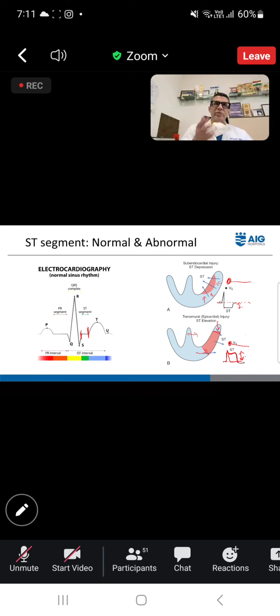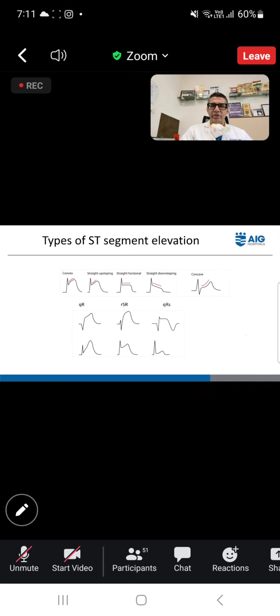So first you identify whether there is any ST depression or ST elevation. Then you find out how much it is, what is the type of ST elevation or ST depression, and in which areas those ST depressions and ST elevations are. So this is the concept of current of injury, which is very important for you to localize. So any place where the injury has occurred, if the whole myocardium has got injured, that will produce ST elevation in that particular area, whereas the opposite area will produce the ST depression. Okay, so that's the concept of current of injury.